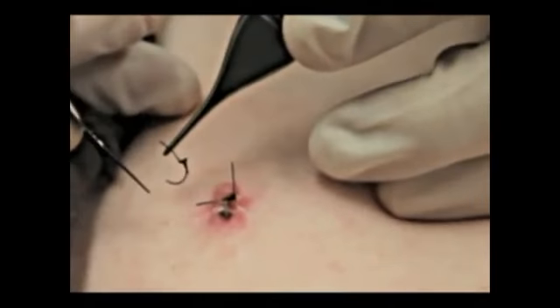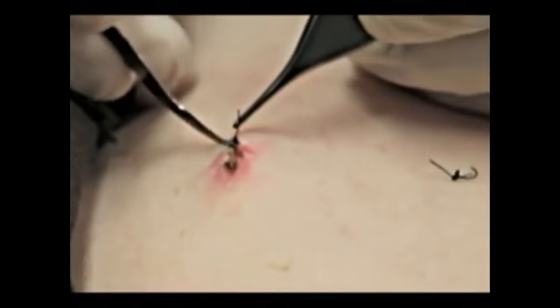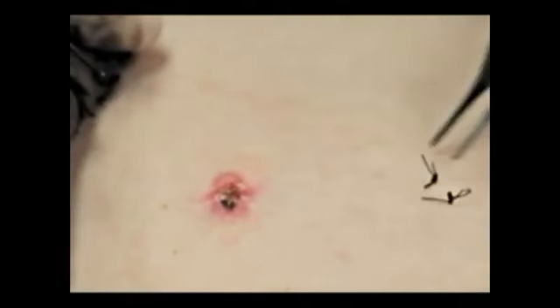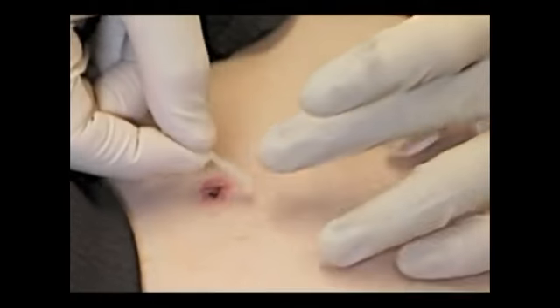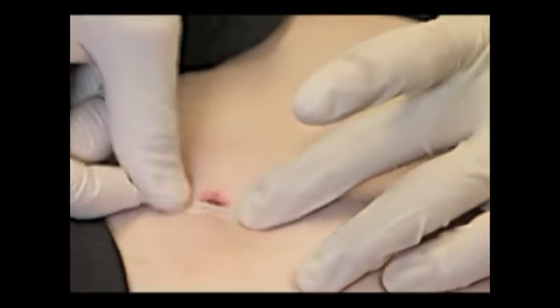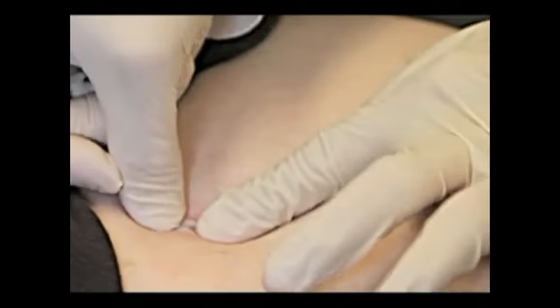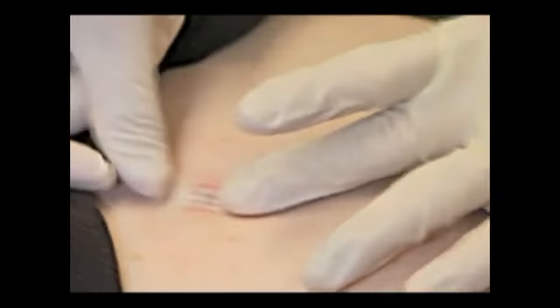Sutures should be removed if necessary 1 to 2 weeks after the procedure, depending on their location. Sutures placed on the face should be removed within 1 week, and sutures on other parts of the body should be removed within 10 to 14 days after the procedure to minimize the risk of track marks and scarring.